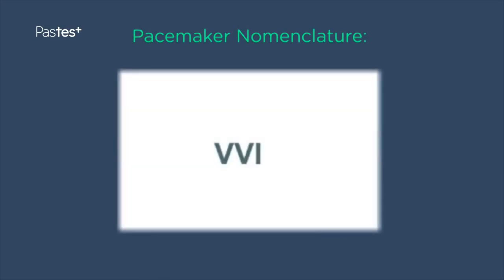Now we know how a pacemaker is programmed by the nomenclature which you'll often see recorded or documented in the notes. I'm just going to spend a moment going through this because this often confuses candidates and sometimes comes up as a question. So let's start with the very simplest kind of pacemaker programme, a VVI pacemaker. What do these letters mean, and how does the position of them in this structure determine what the various functions of these pacemakers are? So the first letter here is V, and this refers to which chambers are paced.